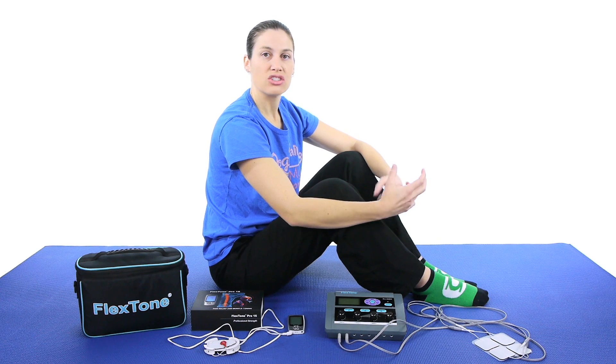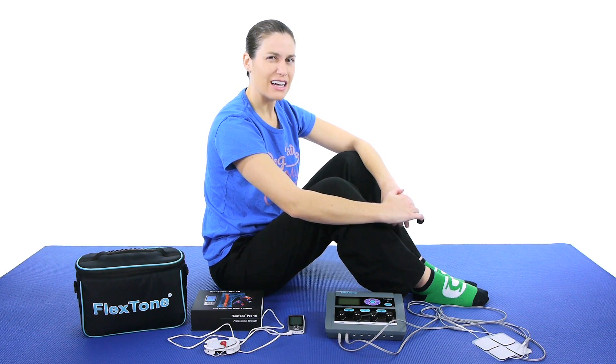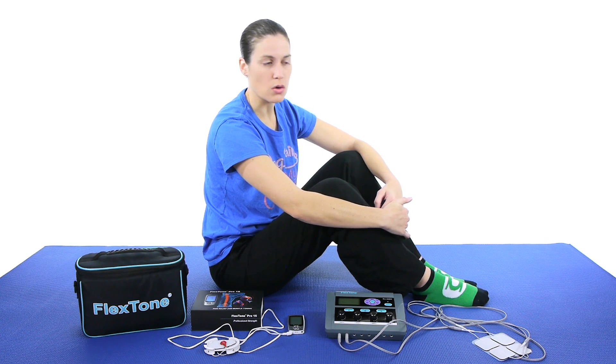The electrical muscle stimulation — the EMS — is used to help gain muscle back. So it actually contracts the muscle. It's a slightly different feeling sometimes. It's slightly uncomfortable, but it's a good uncomfortable, because it's making those muscles work.